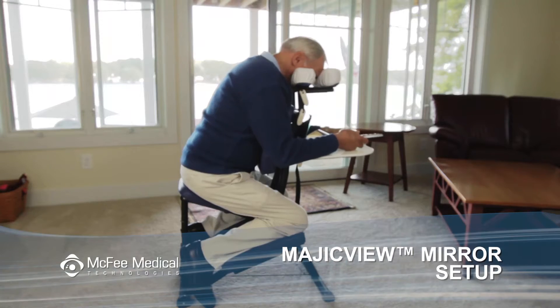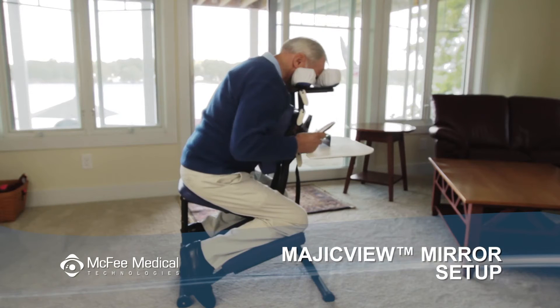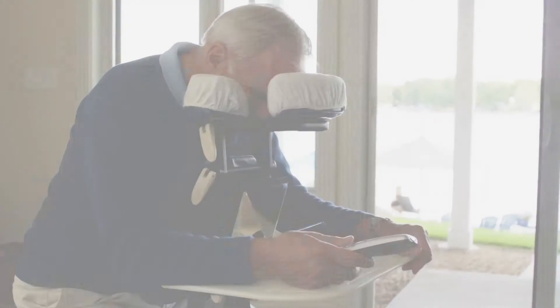Your Magic View Mirror is a patented device designed to make your recovery period more tolerable by enabling you to see objects directly in front of you while in the face-down position.